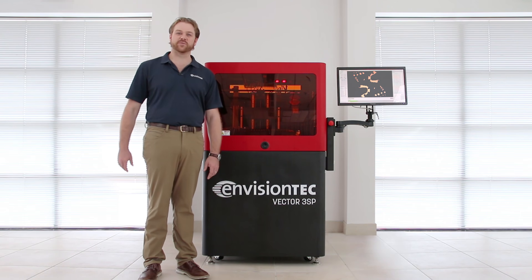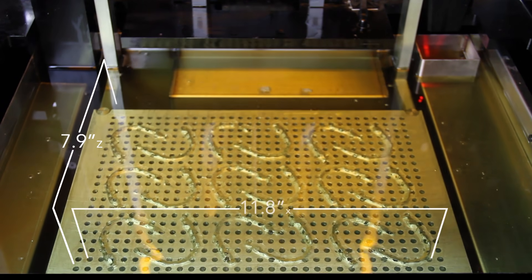Hi, this is Chris Cabot with EnvisionTech and I'm standing here with the Vector3SP, a large-frame model 3D printer for both the orthodontic and dental laboratory.